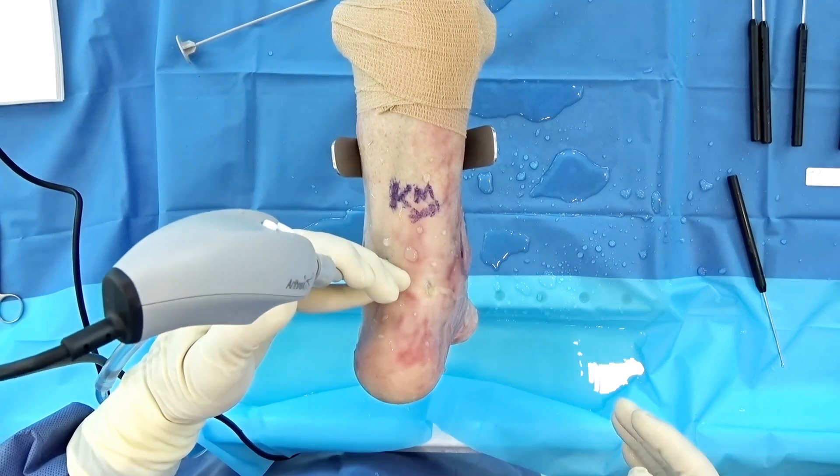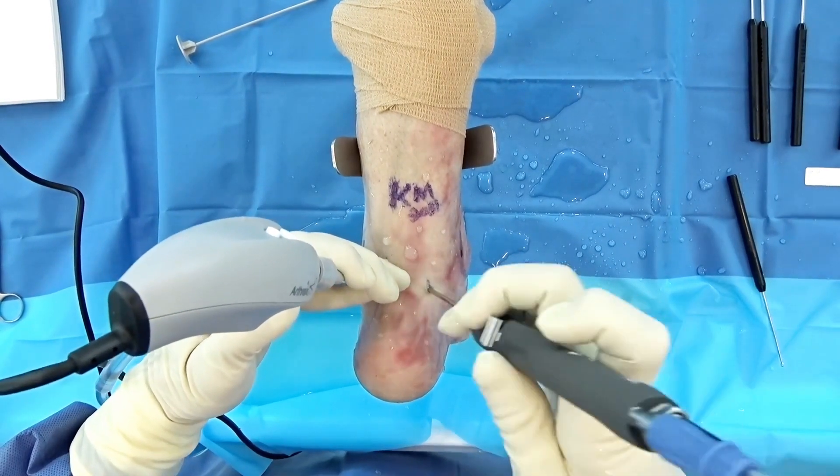After you get the cartilage off and can visualize it, the burr is also a great feature. Being able to come in here and make our pock marks — make it look like the surface of the moon, or as Dr. Cheney said, a battle zone — and put some marks in here. Small but powerful. When I first heard how small this shaver and burr were, I thought there's no way it'll do what I need. But as you can see, this thing just works. That area is already ready for fusion.